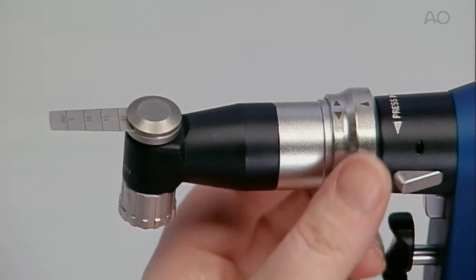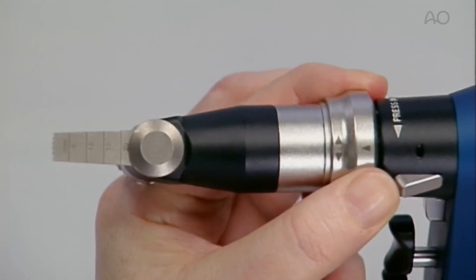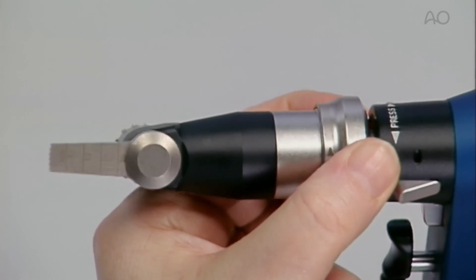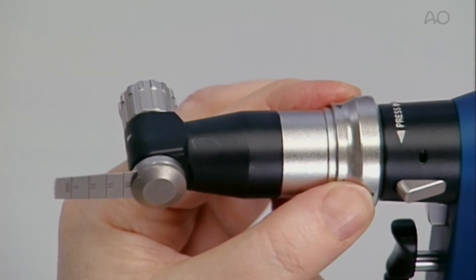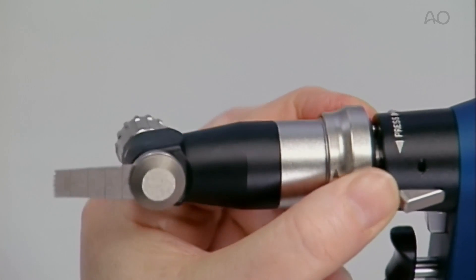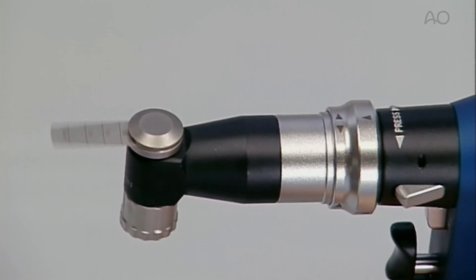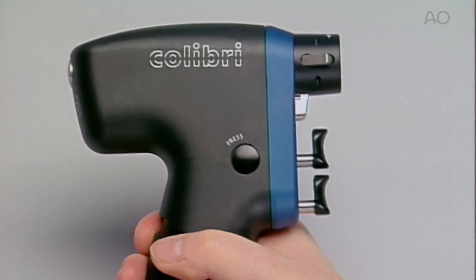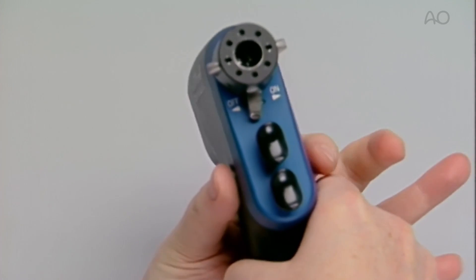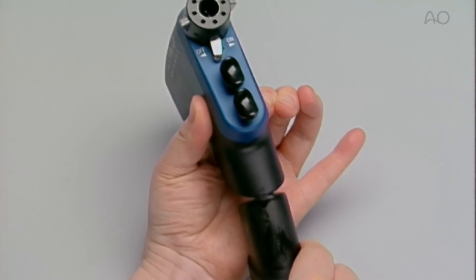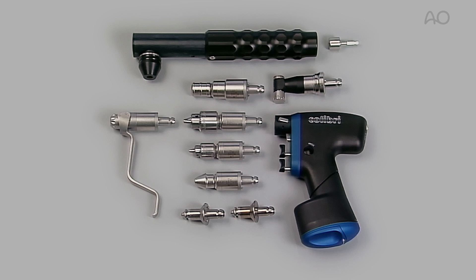The saw attachment can be rotated in 45 degree increments for appropriate use. By depressing the buttons on both sides of the drive, the battery can be removed. There is a complete range of attachments for the Calibri.